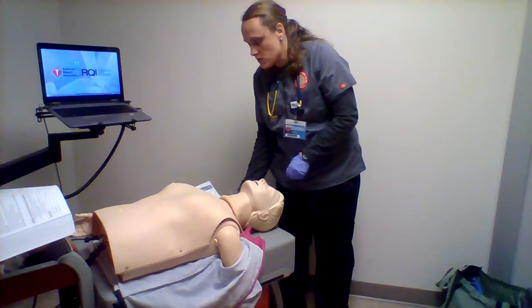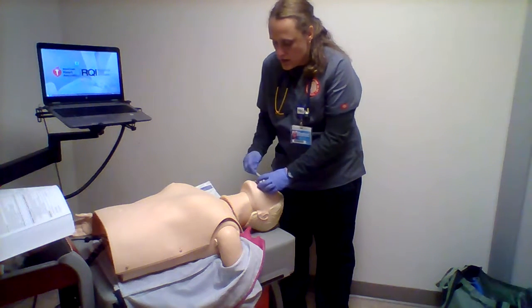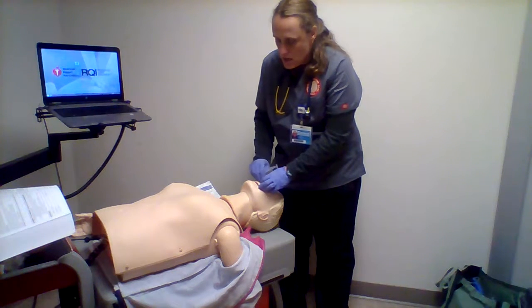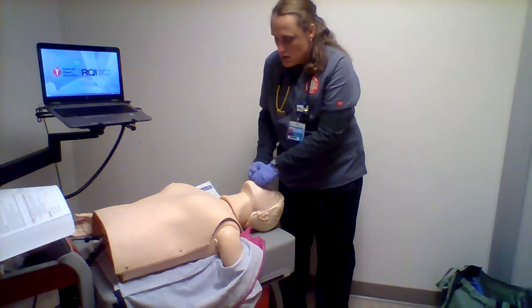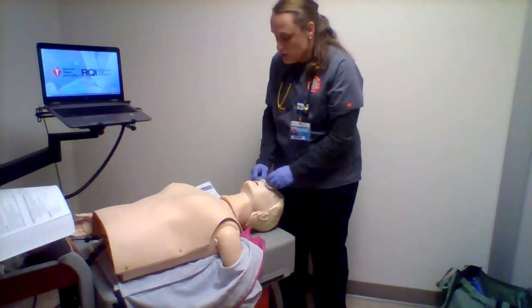So I'm going to lubricate this with some lubricant, bevel towards the septum, and gently insert. If I get a lot of resistance, I'm going to try the other side. I'll get the flange up even with the nostril.